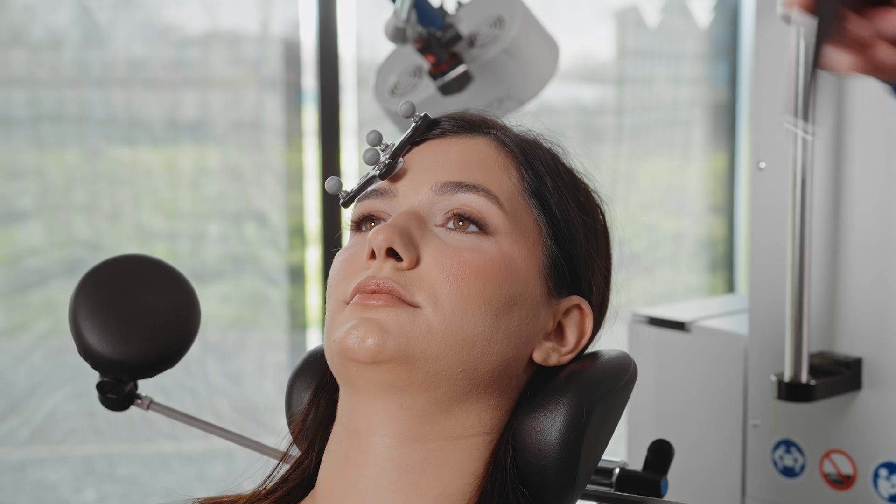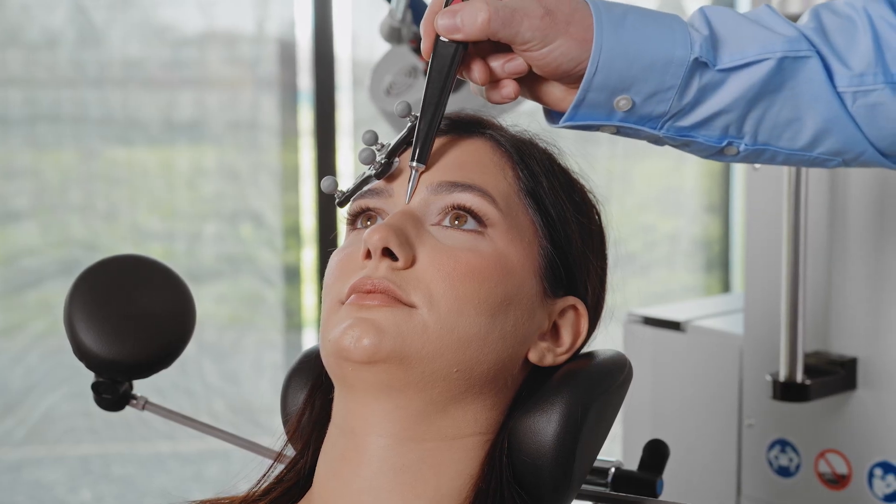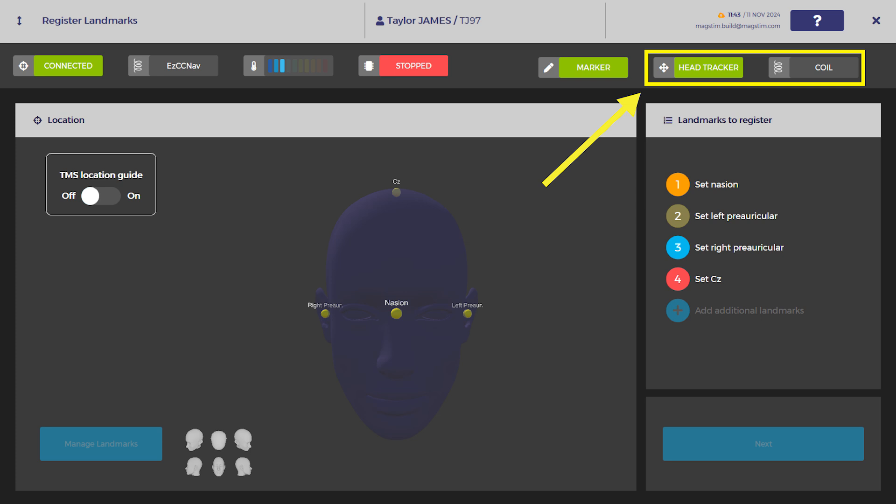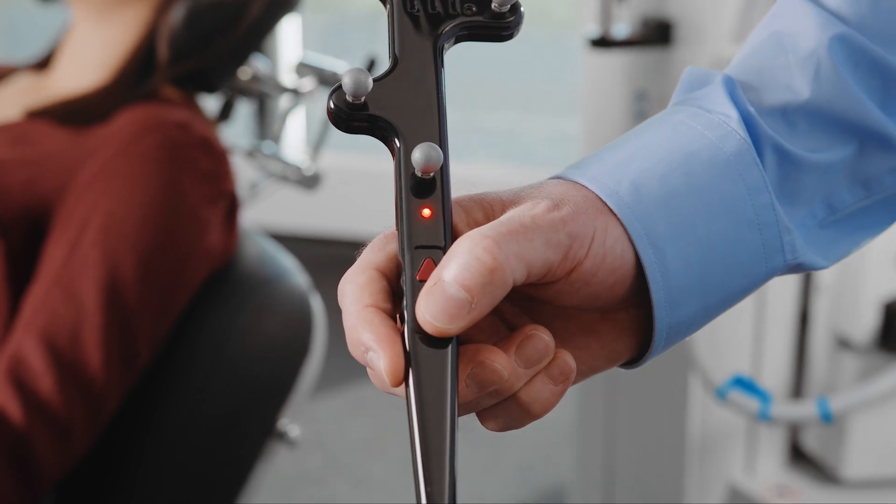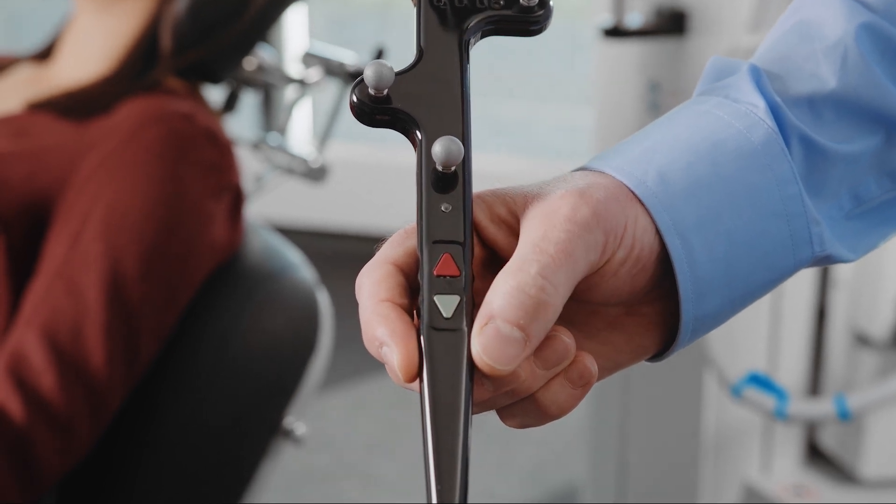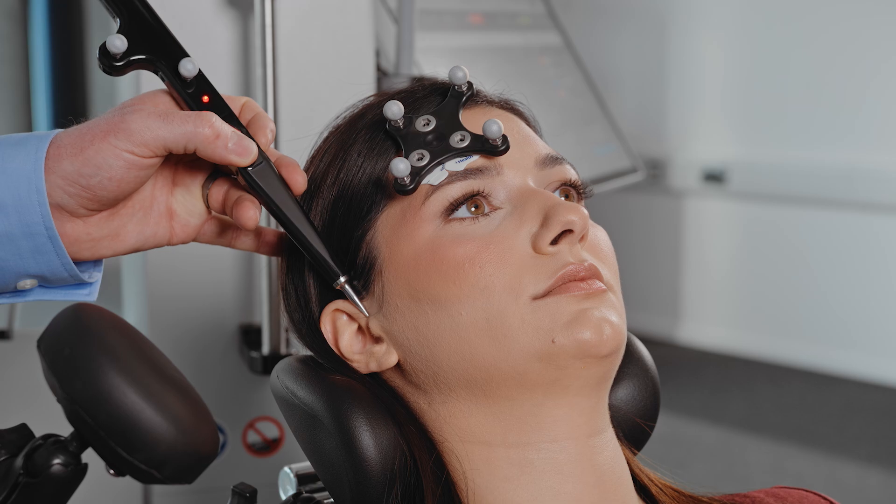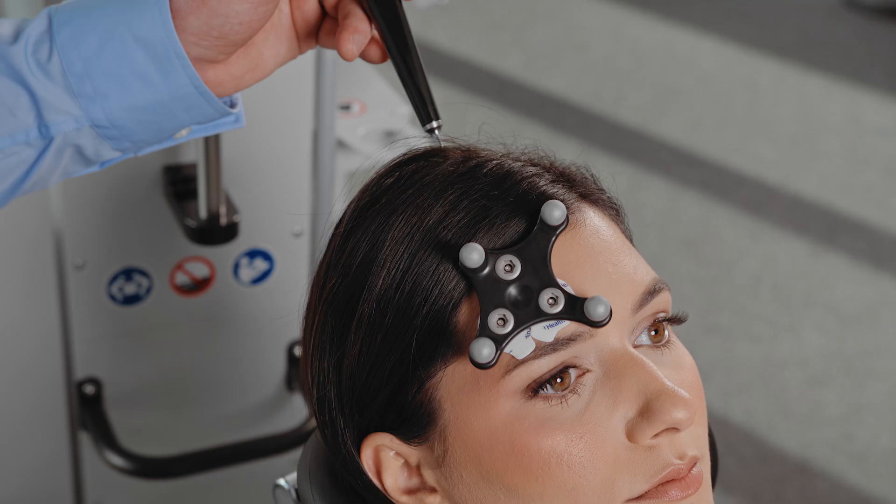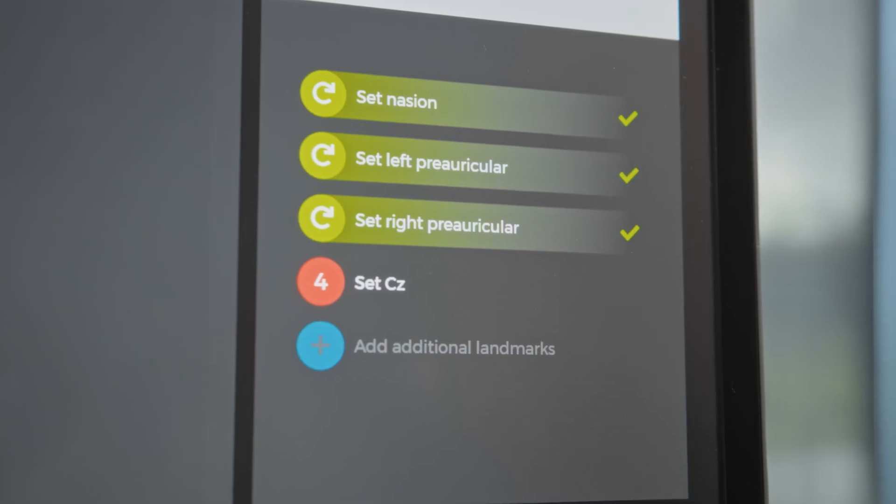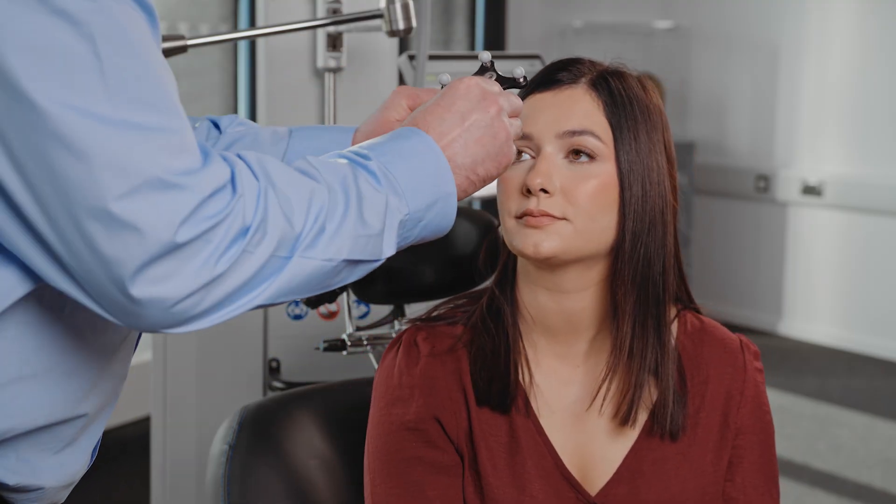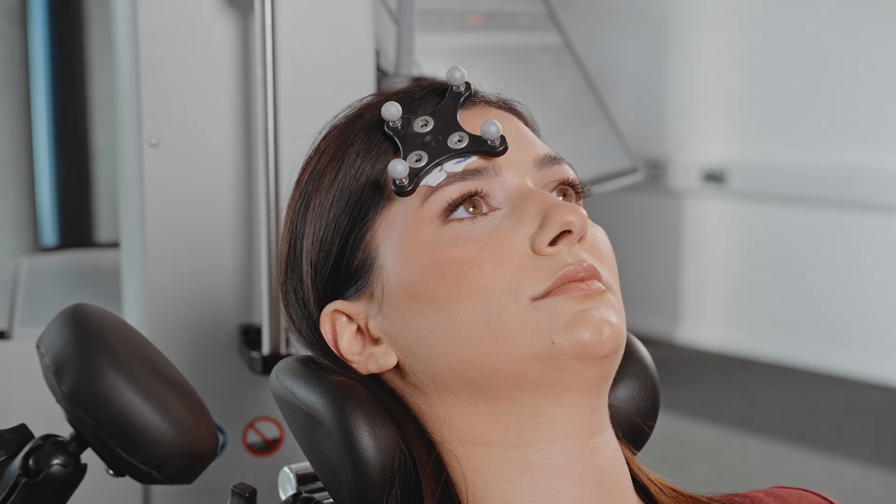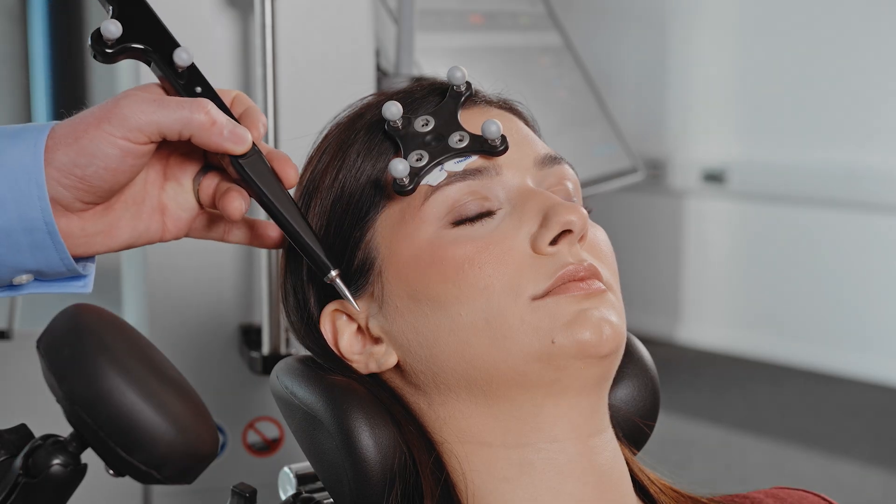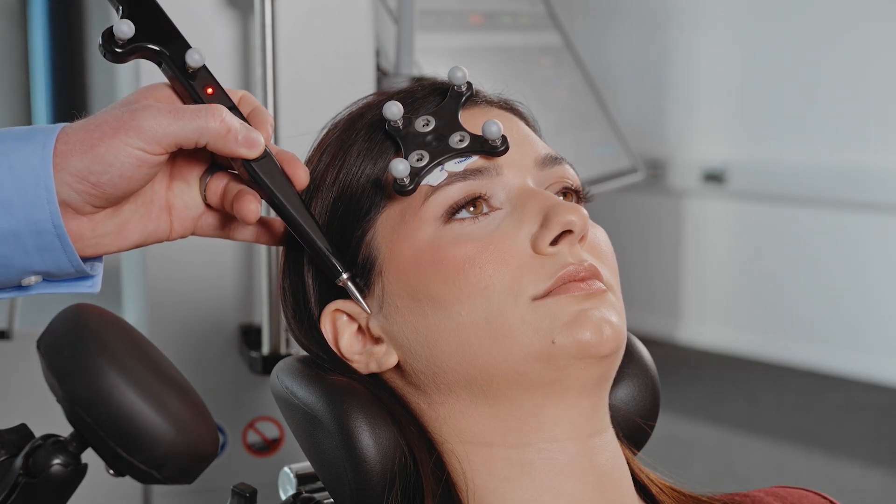Carefully position the remote pointer tool on the landmark sites. Confirm that the pointer tool and head reference's statuses are green on the Horizon UI. Press the green button on the remote pointer tool to register the landmark site. Note that hair or fingers may block the field of view between reference tool spheres and camera, which could result in the tools not showing as green on Horizon UI.